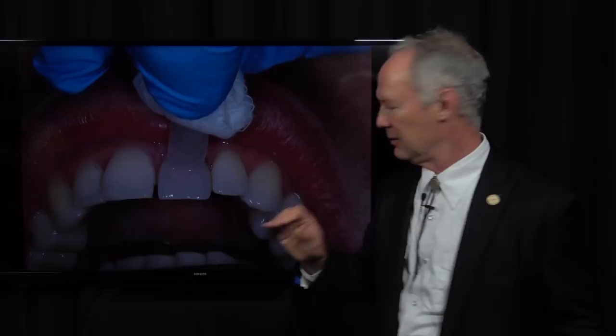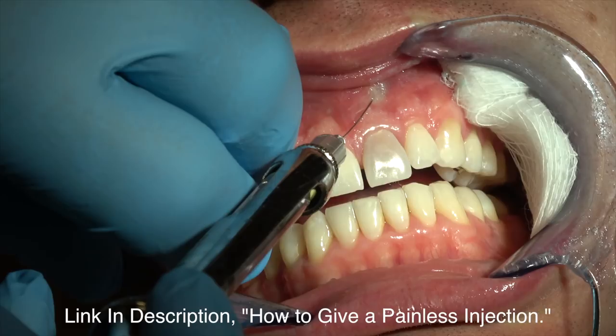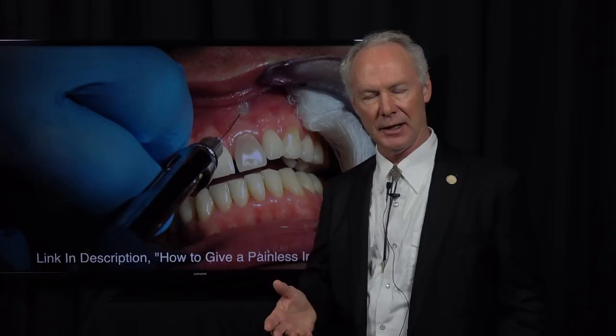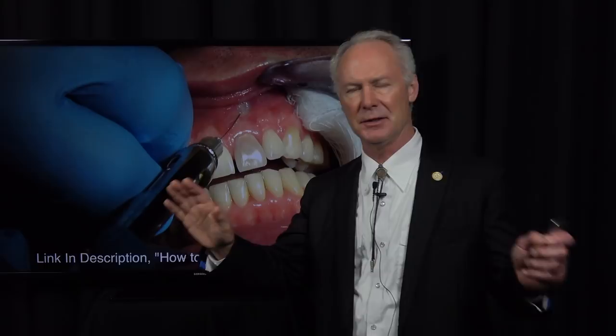What will probably happen is the patient is going to feel the stimuli of the ice on the adjacent teeth, but he won't feel it on the damaged tooth. In that case, you know this tooth is going to require endodontics. This is local anesthetic — watch the video on how to give a painless and profound local anesthetic injection. Your patients will love you. I hear all the time that dental procedures, including local anesthetic, were painful in the previous dental office. It's so easy to give a totally painless and profound dental injection — watch the Dental Minute video on that procedure.